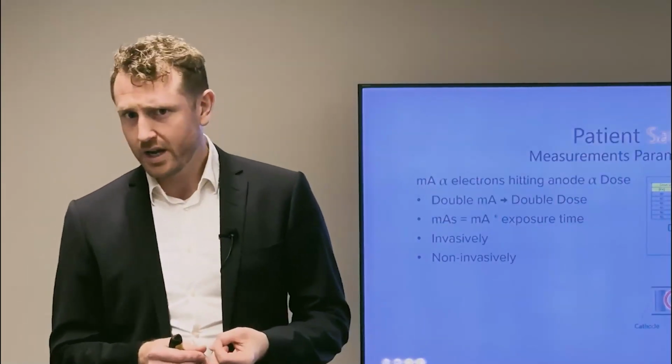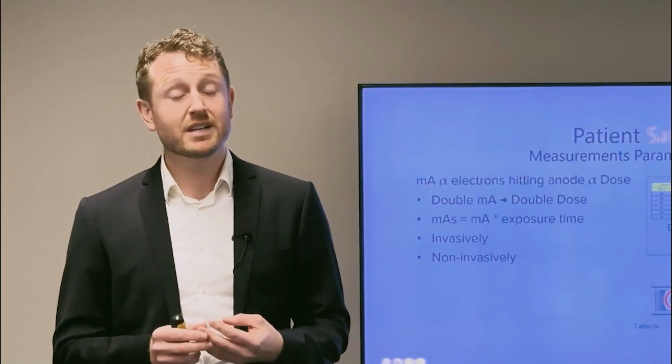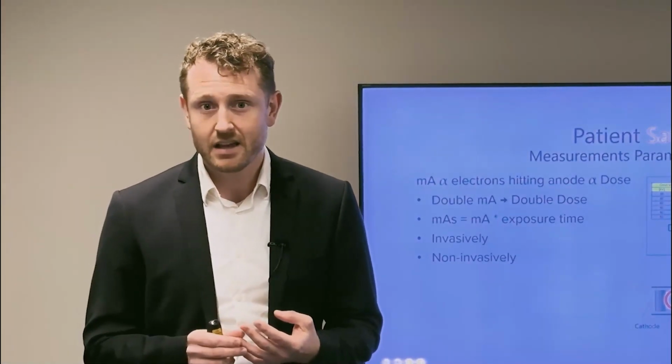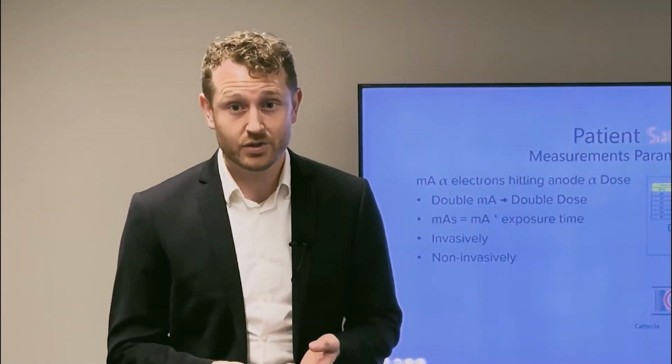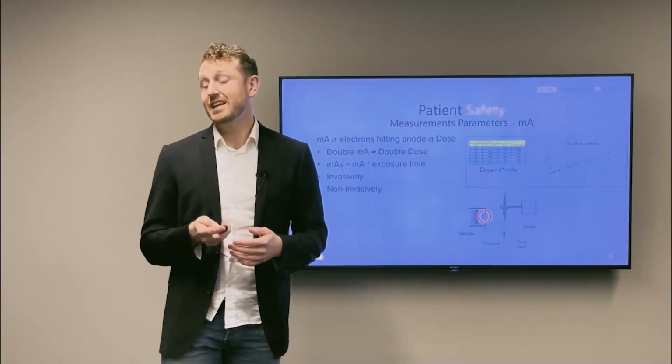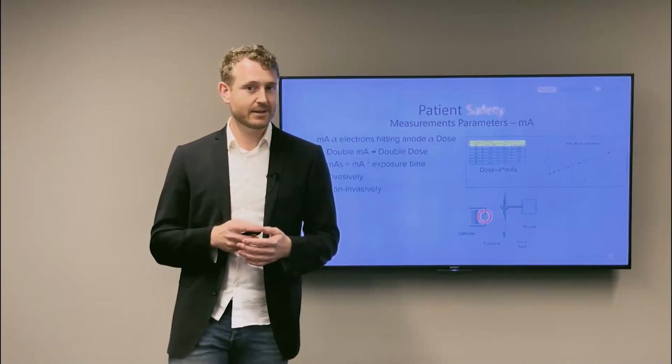There is also a third way, and it is to measure dose from the machine output. Dose is directly related to mAs, but one can still not make too big conclusions since there are more parameters in place affecting the dose. But measuring dose can be a first and easy step to get an indication of a changed mAs.